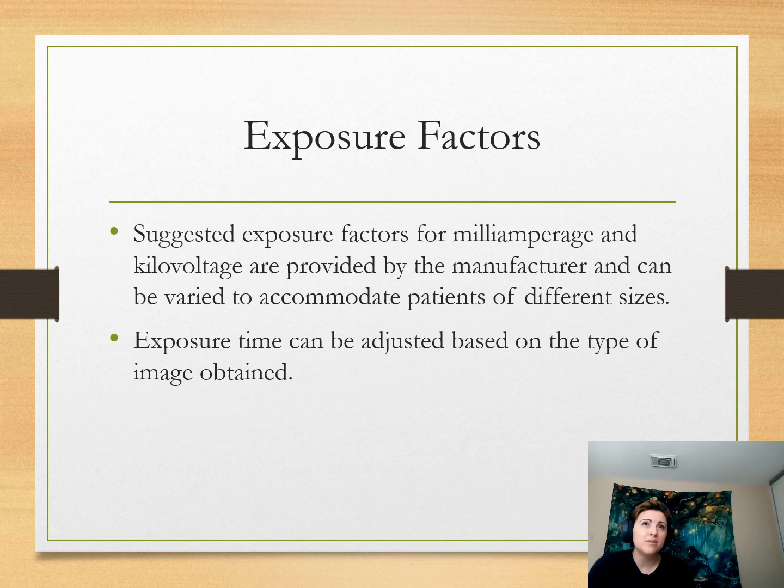The panoramic imaging time varies depending on the receptor and the x-ray unit, but it always will run anywhere between 10 to 30 seconds depending on the patient. So it really just depends.